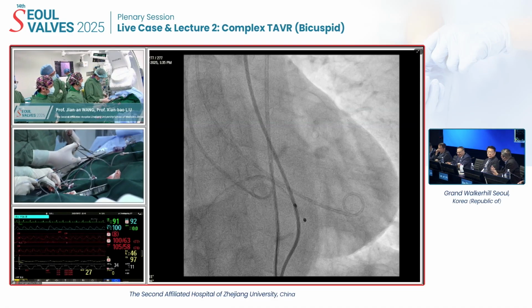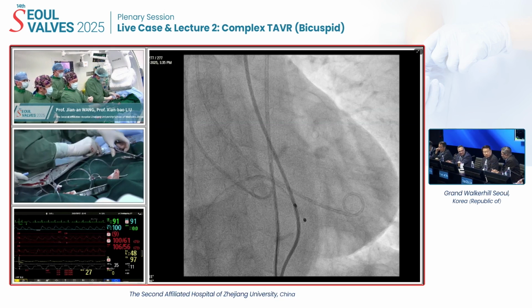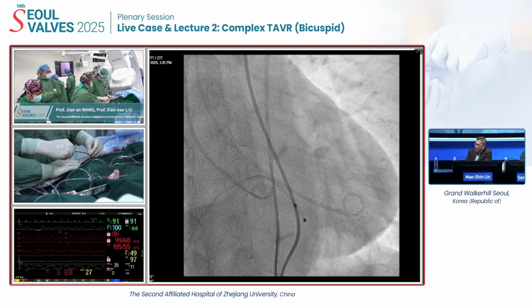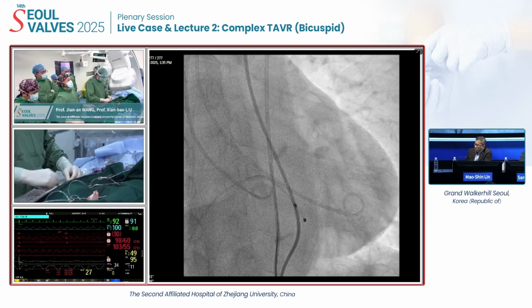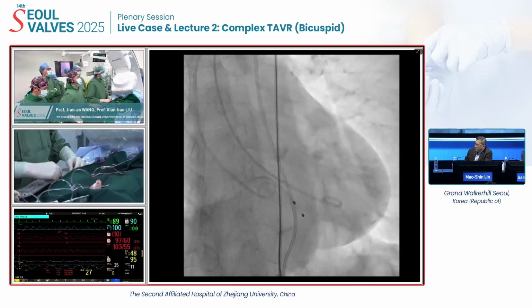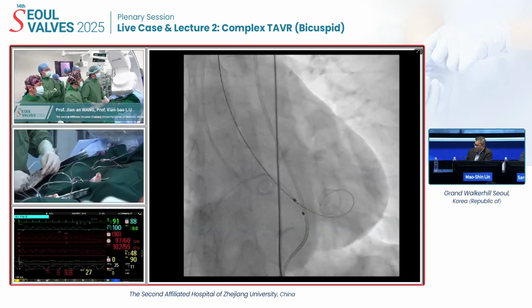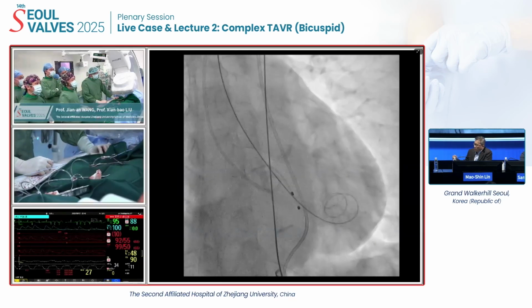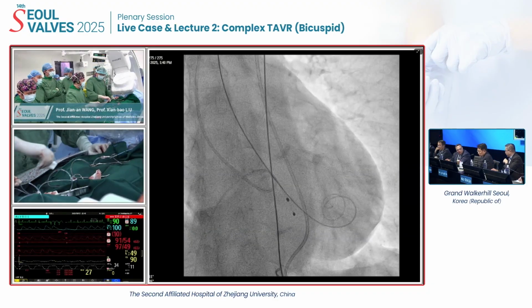I think personally, we still have a lot of ways of sizing. Use the circle method or the waist method, because using the Hangzhou solution sizing method, I'm a little bit worried about that, because when you do the balloon dilatation, your valve is not yet prepared. So once you have acute aortic regurgitation, you have to be ready. But the Hangzhou solution depends on your balloon inflation and contrast injection to choose the size. So you have to have the solution already before you even blow up the balloon, is what you're saying.